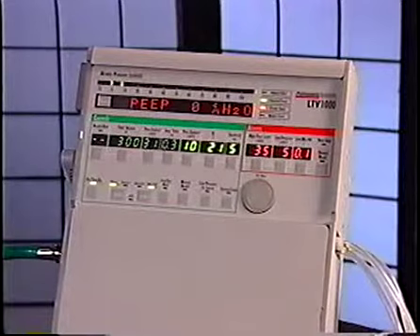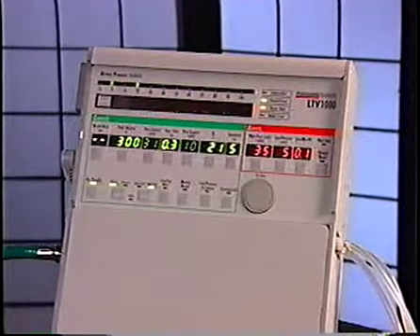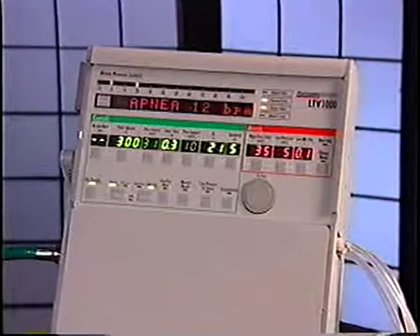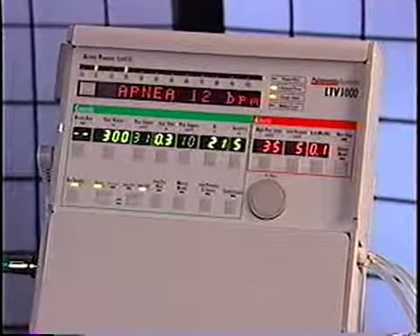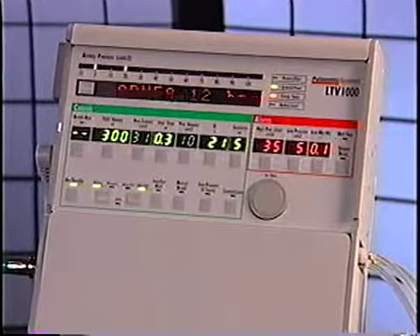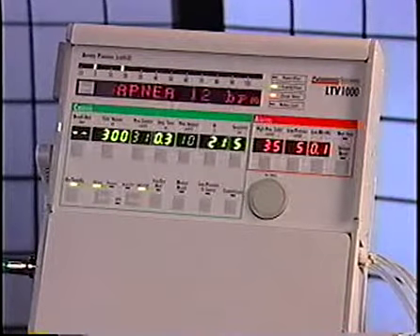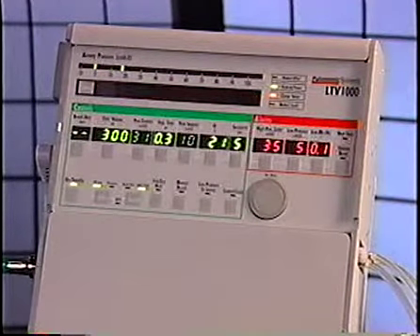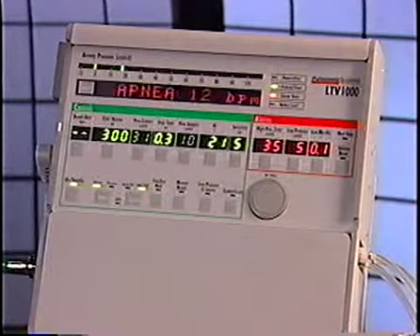The LTV provides an apnea backup mode of ventilation. Apnea backup ventilation begins when the time since the last breath start is greater than the set apnea interval. When an apnea alarm occurs, if inspiration is in progress, the ventilator cycles to exhalation. The ventilator begins apnea backup ventilation in the assist control mode, according to the control settings. The active controls are displayed at full intensity, and all other controls are dimmed.